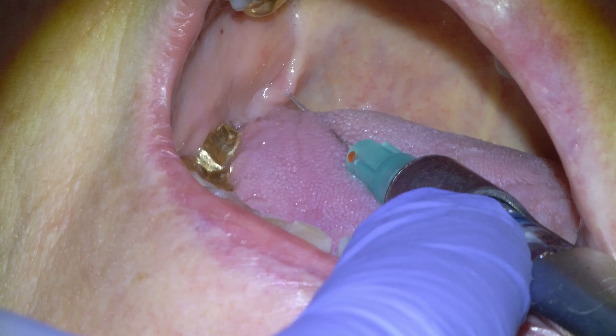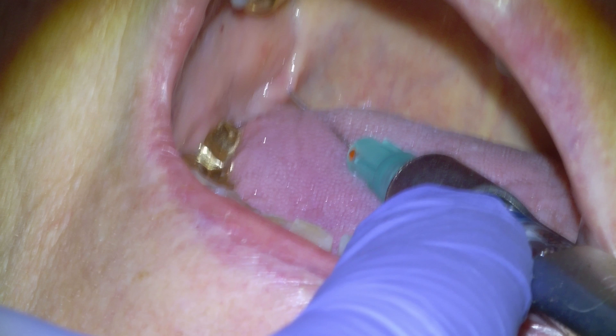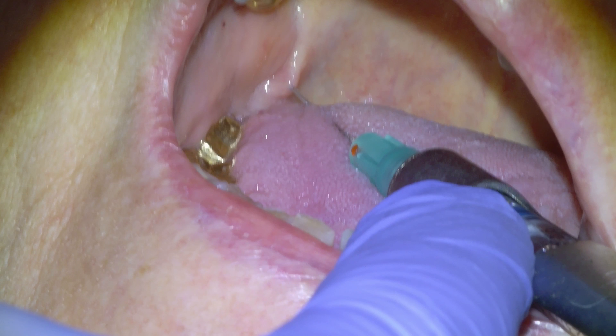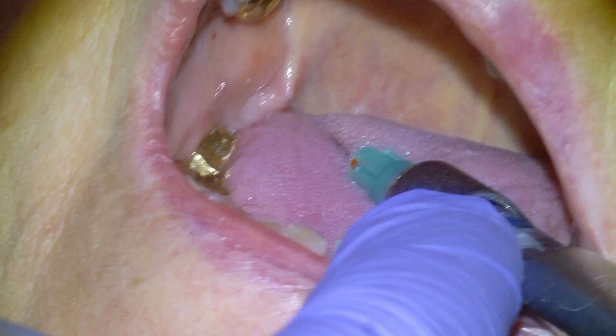If the lip and chin goes numb right away, or you get an electrical shock sensation at the lip and chin, you know that it's a direct hit. If it takes a while or it just goes tingly without feeling fat, then you need to give another one. The right side should feel fat, right up to the midline — the left side should feel totally normal. Let them know that the tongue and the cheek will go numb as well, because sometimes they'll feel numbness and think it's working. But if it's not in the lip and chin, then you didn't hit the block before it enters the mandibular foramen, and they're not going to have pulpal anesthesia.